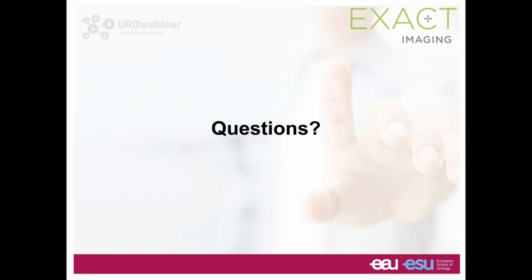Strain elastography is available for almost, I would say, all ultrasound manufacturers dealing with the prostate and on prostate transrectal transducers, while shear wave elastography is available only on a few ultrasound manufacturers. And of course, the literature is much more recent. So I would say it requires more publications, more training, or more experience, more studies than for strain elastography. The literature for strain elastography is quite rich now.